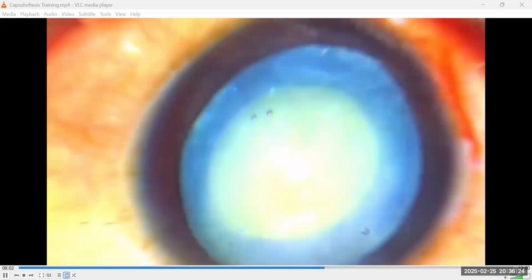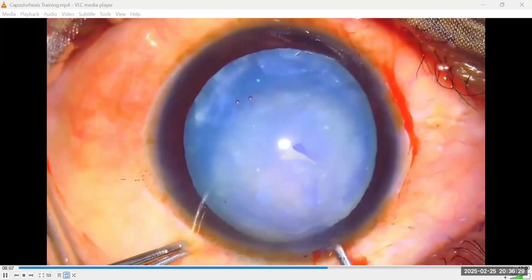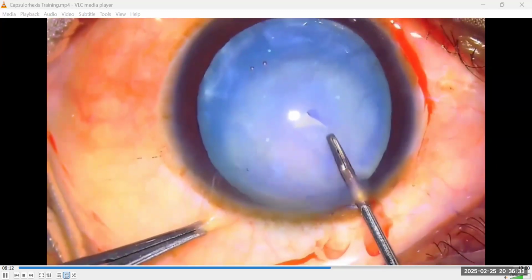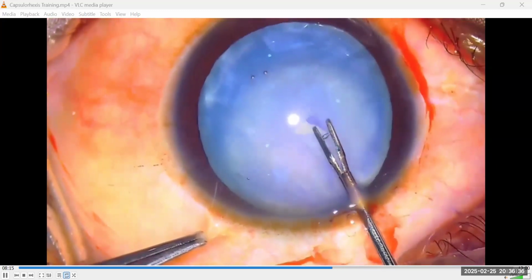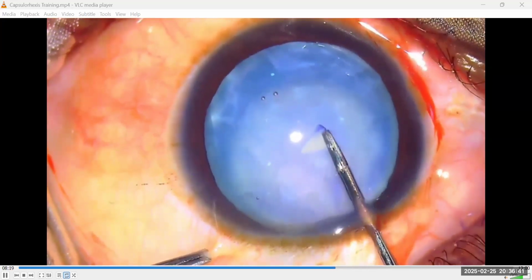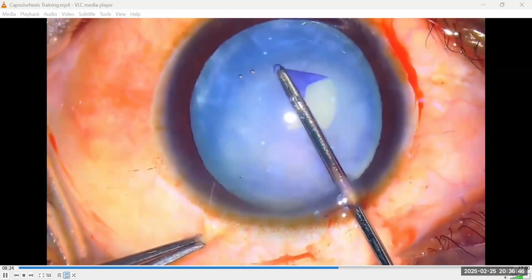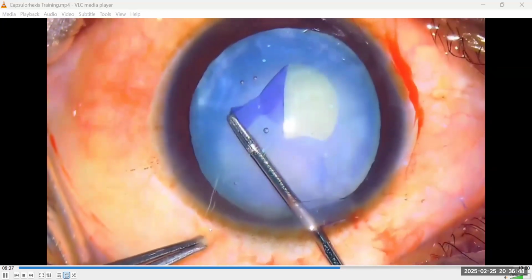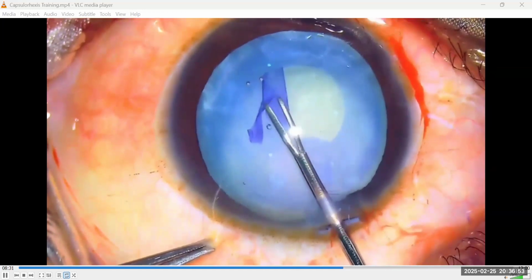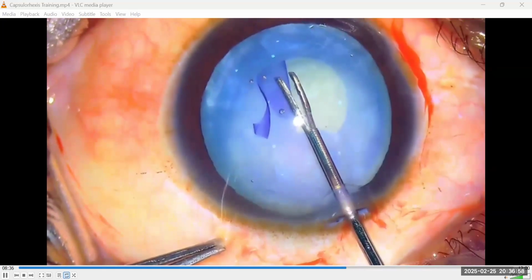Okay. This is a slow motion of what I just did now. Watch the visco come out. Yes, it does come out. Is it continuously coming out? I think so, but slowly. To stop it from coming out continuously, lift your hand up so that the anterior part of the tunnel will pull the posterior tunnel up. Any visco will go underneath it and get trapped there.